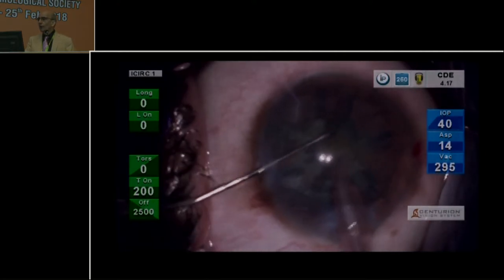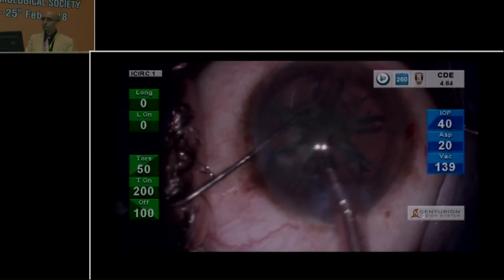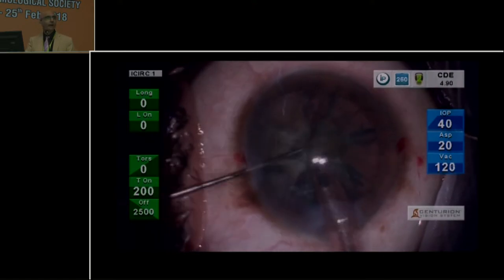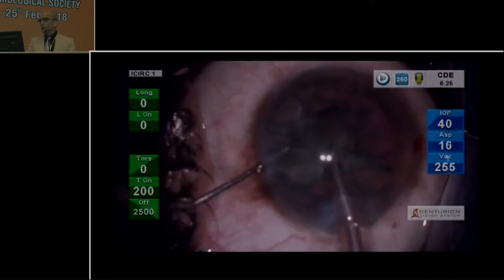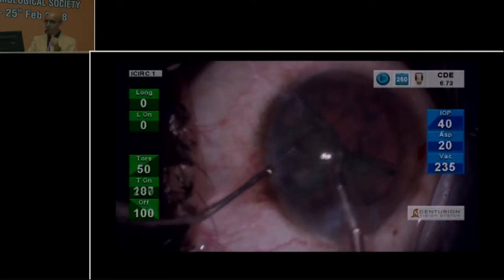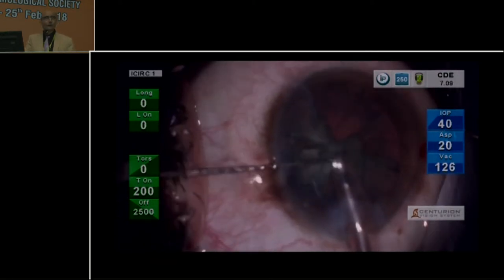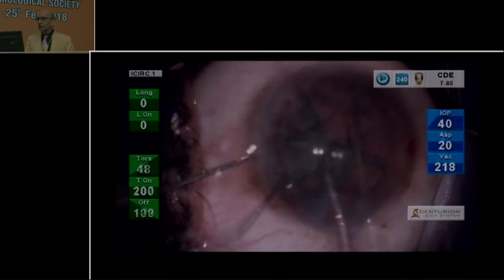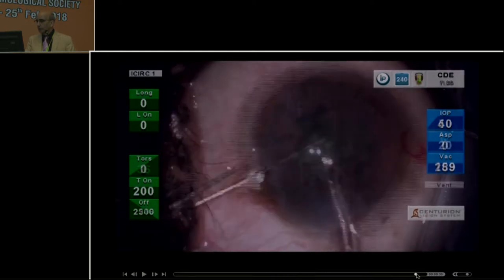Use a low flow rate of 16 or 18cc per minute, use energy appropriately, and use minimal vacuum. If you have already had a lens fragmentation or femto procedure performed, we prefer that. Even with RK incisions, most of the time you can produce a good division and rhexis of your desired size. The bottle height is very important — as low as you can, but enough to negate surge and maintain stability of the eye. This is something very special to the compliant globe.